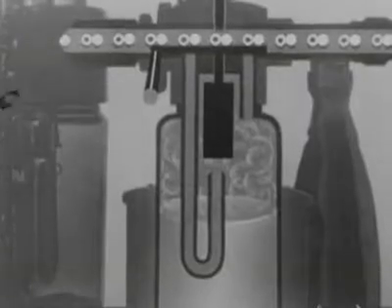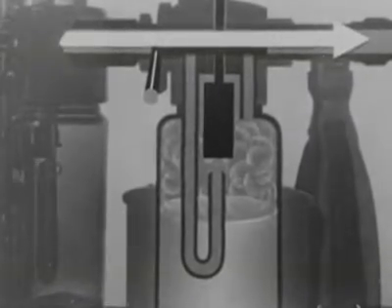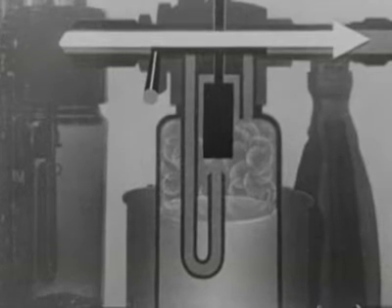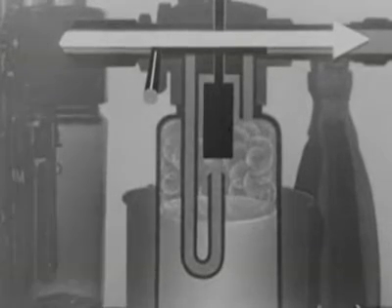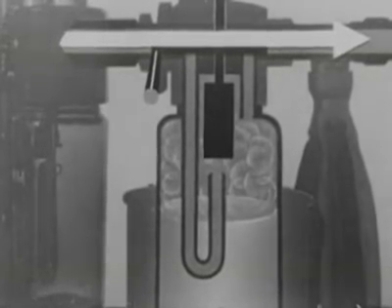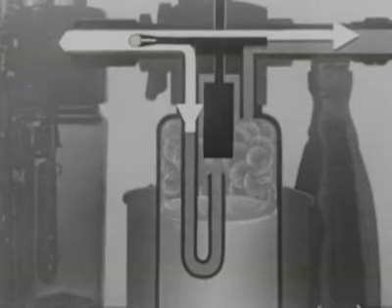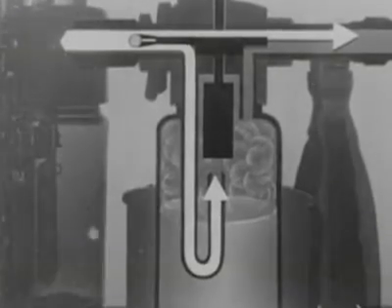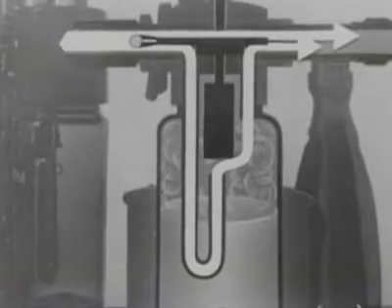Here is the ether bottle in section, with gases flowing past the entrance. This arrow shows the direction of the gases. When ether is needed, the gases are diverted into the bottle, where they pick up ether vapor and carry it with them. A tap on the ether bottle controls this. Here it is turned half on. A portion of the gases continues to flow straight on. The remainder passes through the J-tube in the bottle, picks up ether vapor and rejoins the undiverted gases.